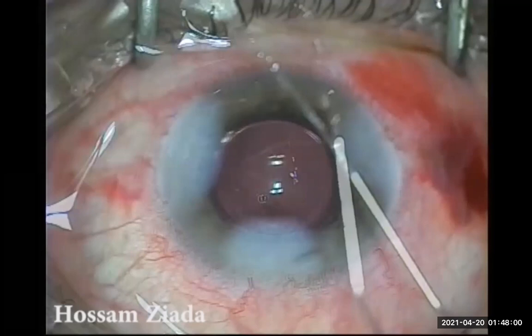The wounds were closed with a very good anterior chamber depth and the lens in position, with no protrusion or back pressure, and no problem with the vitreous cavity. The patient went home the same day. I prescribed antibiotic and dexamethasone eye drops only — no antiglaucoma drops. On the second morning, the cornea was very clear with good anterior chamber depth and clarity, and the patient could see 6/60, which made everyone very happy with the results.